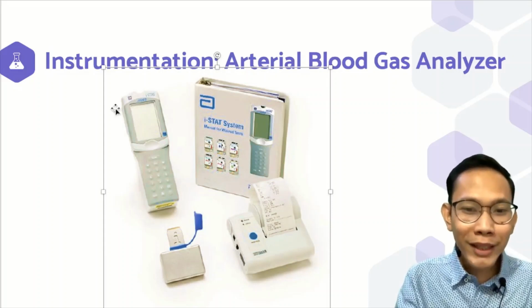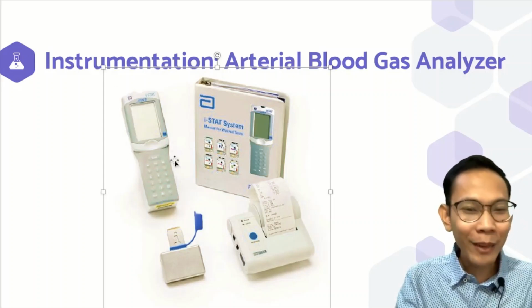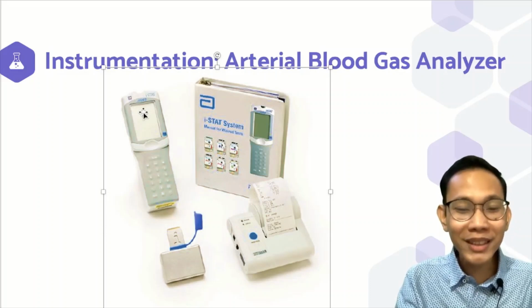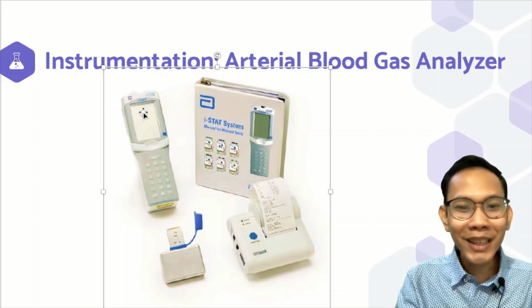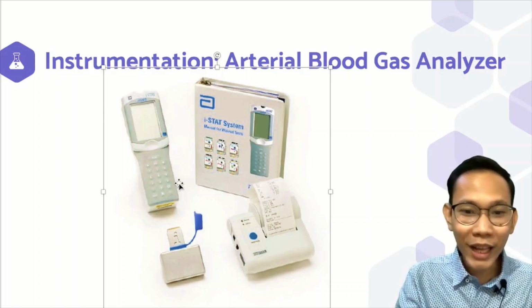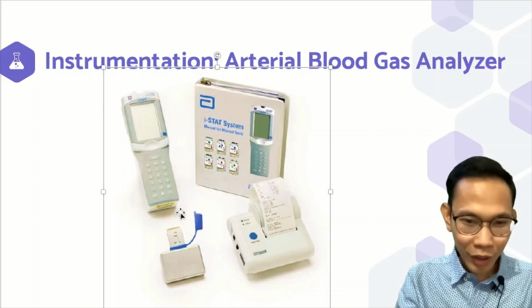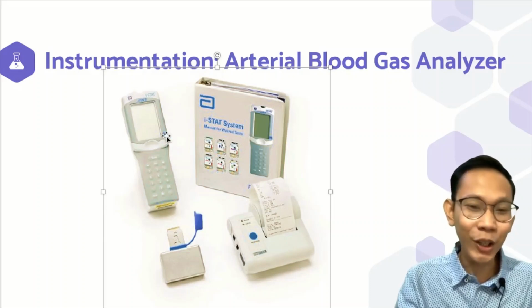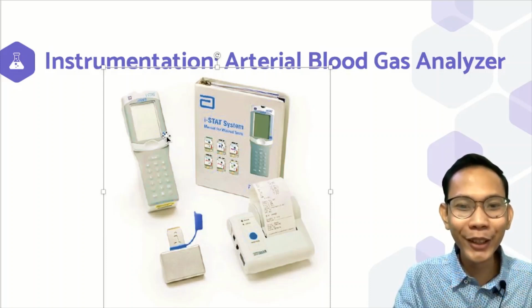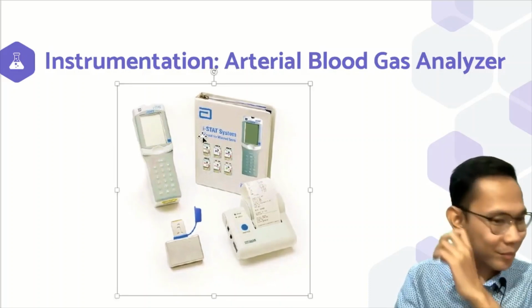Okay? You know what? This is very expensive. Sa sobrang liit nito, nasa drawer lang to namin, it costs million pesos. I'm not sure kung ilang million, basta this is really a million pesos. Kaya nga, pag magra-rounds kasi, maraming uses ito, hindi lang ABG, it can also detect your electrolytes. So, pag magra-rounds kami, ito na dinadala namin, tapos nilalagay namin yung cartridge para ma-detect na yung mga electrolytes dito automatically. Very expensive ang mga devices natin, no?